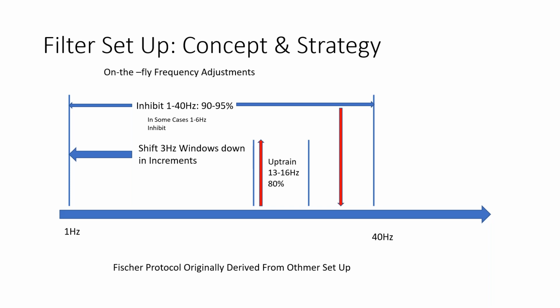It's not a big danger to shift a band a little bit up and down to try to get a better result. We've heard Martin saying, well, I like to train SMR at a slightly lower frequency range. And that's fine, and Rob may not. Martin doesn't probably know it because he's not a big consumer of research all day and all night, or junkie like me, but there is support for Martin's ideas, and people have been doing what Martin was suggesting 20 years ago. We were notching down 13 to 15 and notching it up, looking for if it would make a difference and the person would do better.